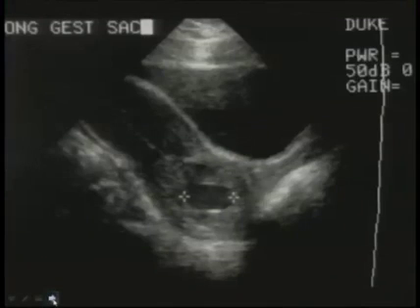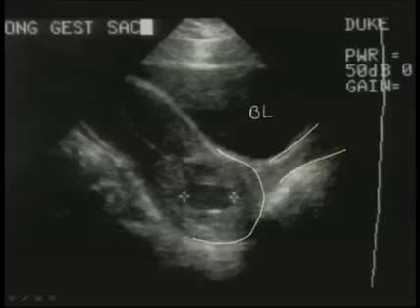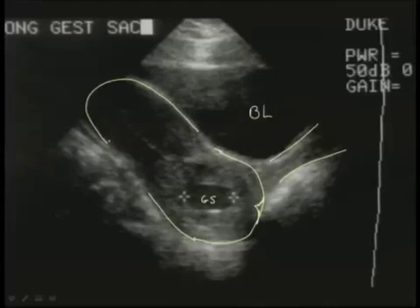This is an example of an abortion in progress. This is the vagina here. This, of course, is the urinary bladder. This is the cervix. And this would be the external os there. And you can see there's the gestational sac well within the cervix, outlined here, the uterus back here, in this patient with an abortion in progress.